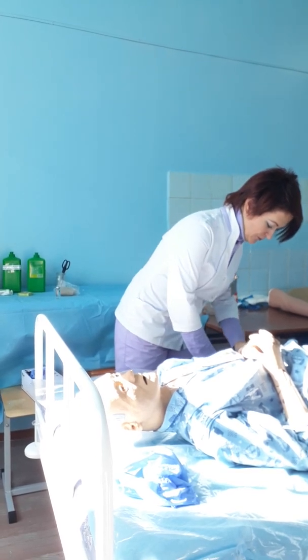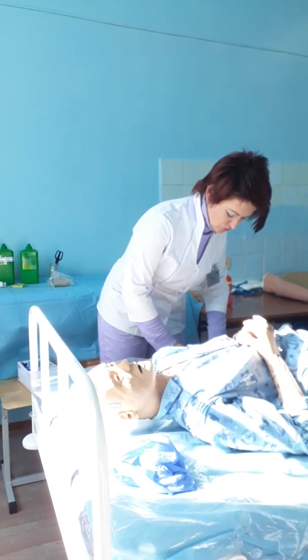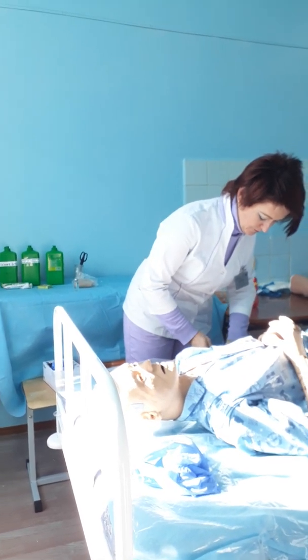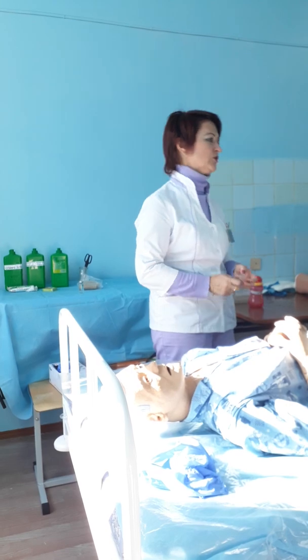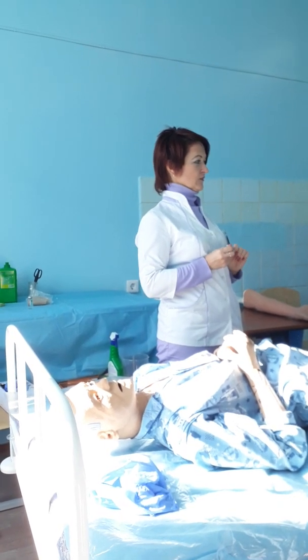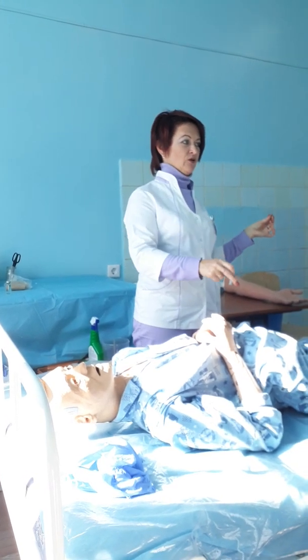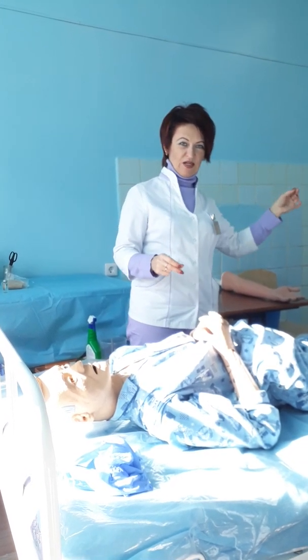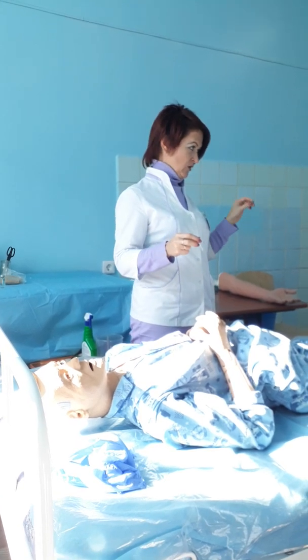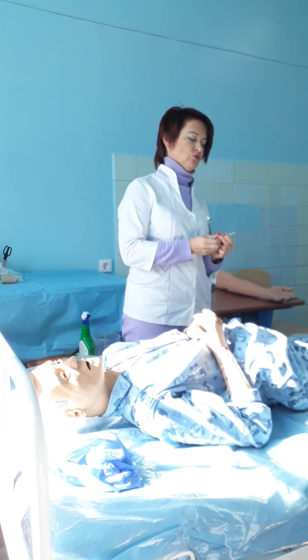And with this syringe comes a special size of needle. What color of needle will you use for intravenous injection? Green. Green, the same as for intramuscular, it's the same size, and more often we will use this size for intravenous injection too.